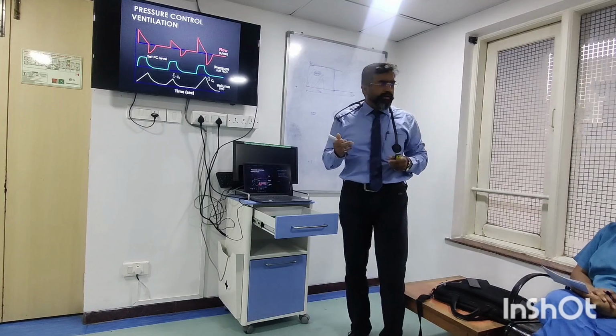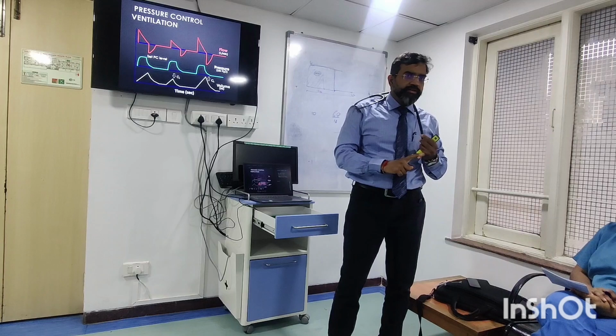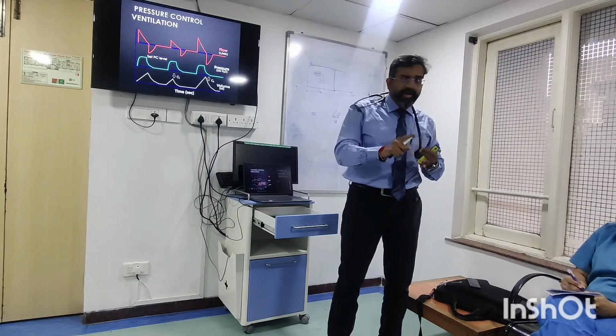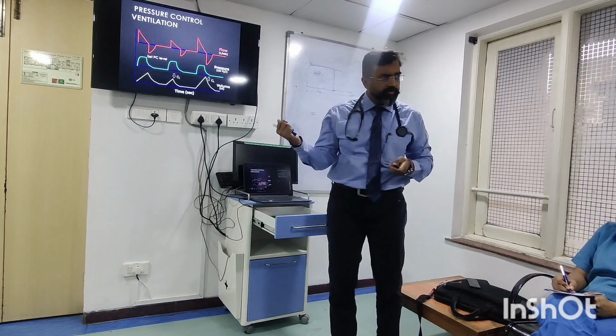So it's time triggered. It is triggered by time. Patient is not doing anything. Okay, it is the machine that is doing it. So machine or time triggered. You understand? The machine is doing everything. Clear on this? Time triggered breath.